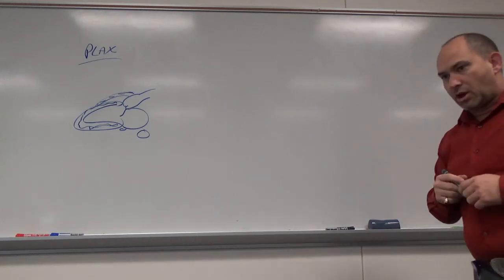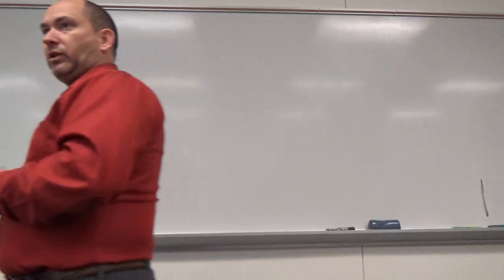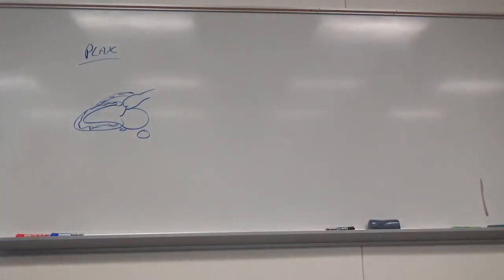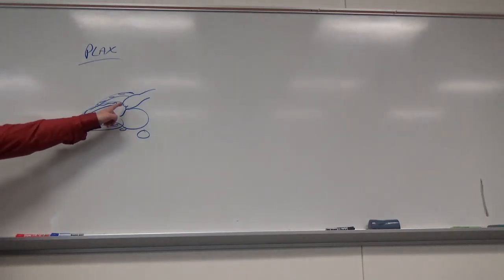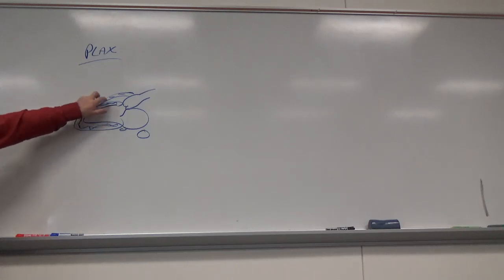So for parasternal long axis, we take the 2D clip, and then the next thing we do is we're going to measure stuff. We could start from one of three things. We want to know stuff about the aortic valve and the size of these chambers. We want to know stuff about the size of the LV and the thickness of the walls, particularly in diastole.